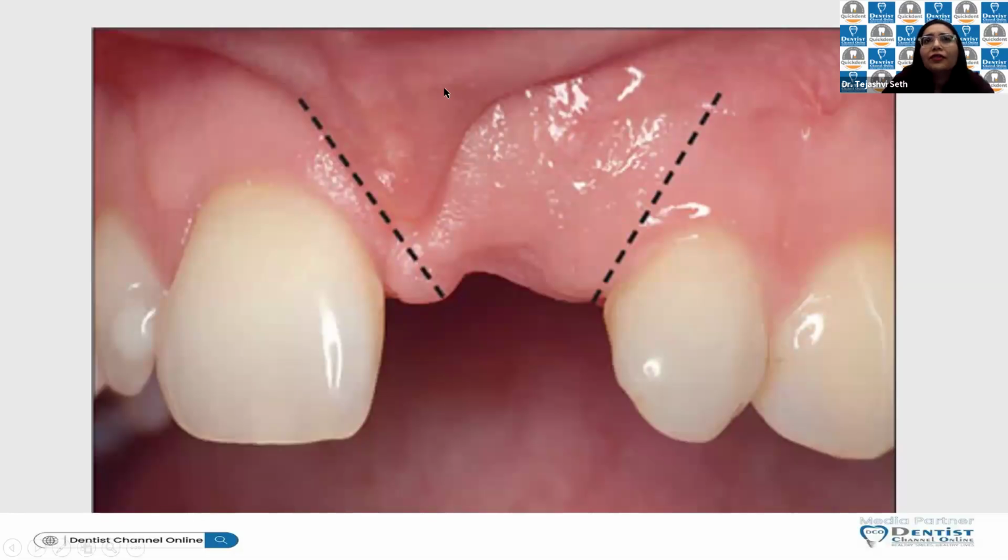See, any kind of pull will cause recession. And most of the time, the frenum does not have that much orbicularis oris insertion. So take an incision and reflect. Reflect your frenum as well till your mucogingival junction, until you're satisfied that there is passivity, and no amount of pull is there.